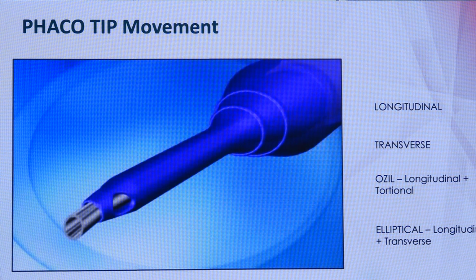The energy is still being released, but there is no cutting motion in the coming back. So there came the transverse motion, which was sideways. So energy was used efficiently in this because cutting is continuously going on. There is no waste of energy, efficient use of energy, less heating problem, wound burn. And combining both the technologies helps in better cutting.